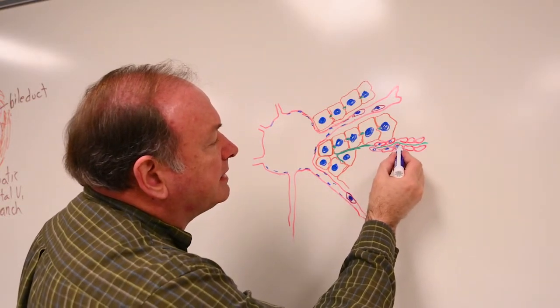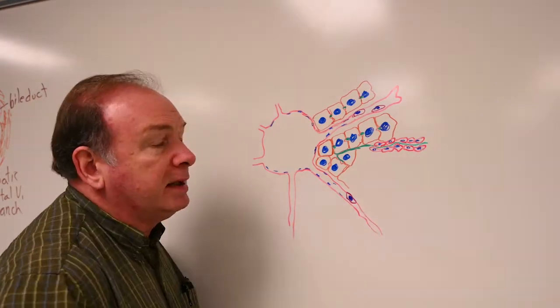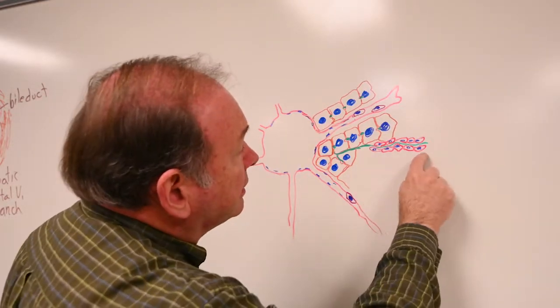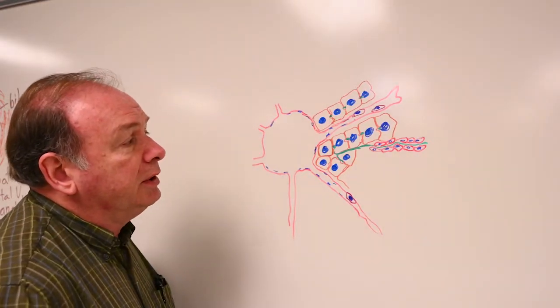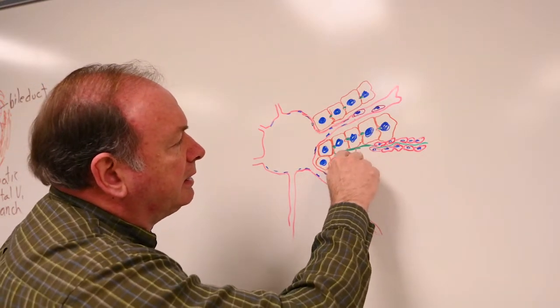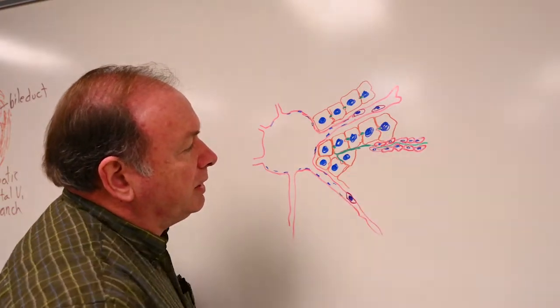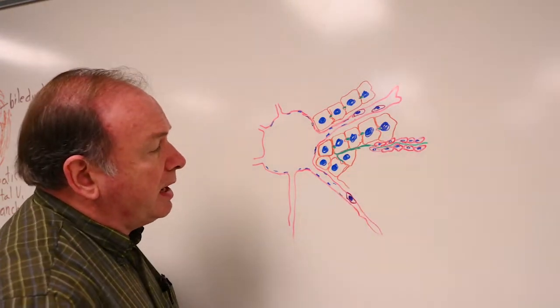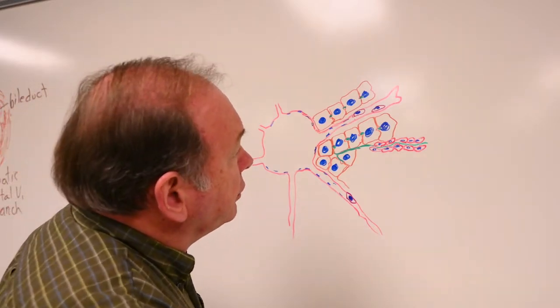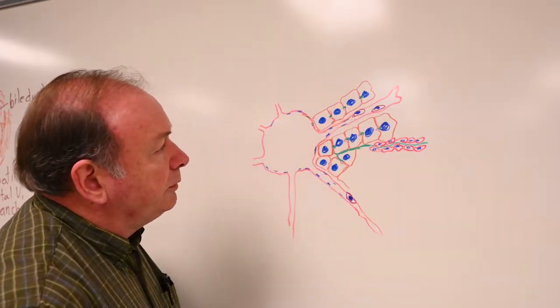They kind of form that stepping stone look like we saw in some intercalated ducts in the salivary glands. But anyway, these small bile ductules that carry bile after it leaves the canaliculus, head through tiny spaces to enter into this duct and then eventually into a bile duct of the triad out at the perimeter of the lobule. So those are things we'll be looking for in the liver lobule structure.